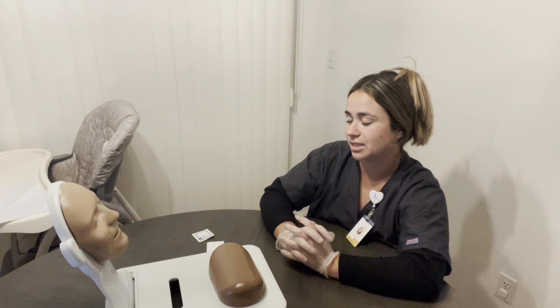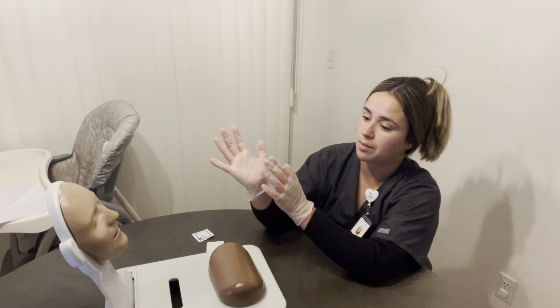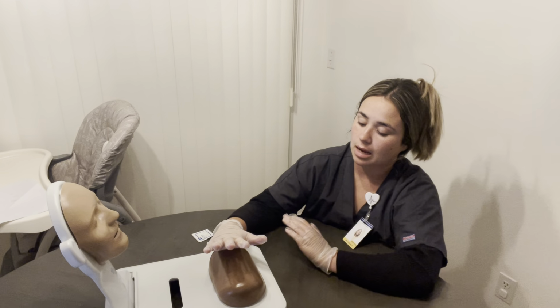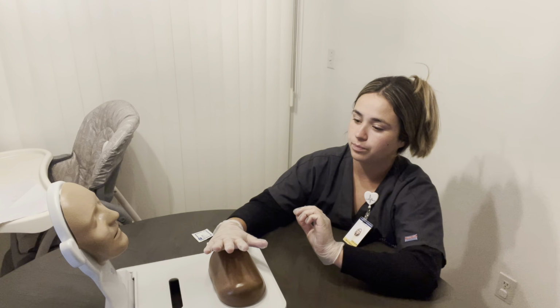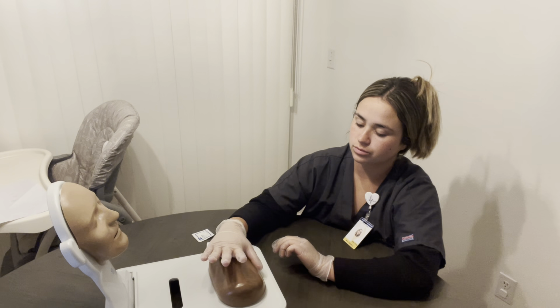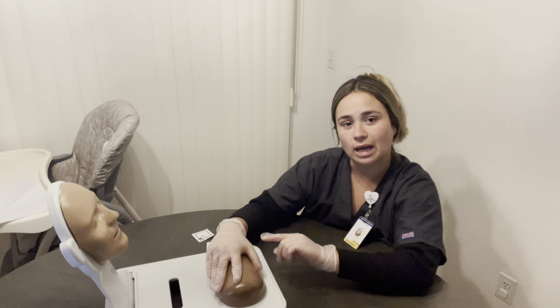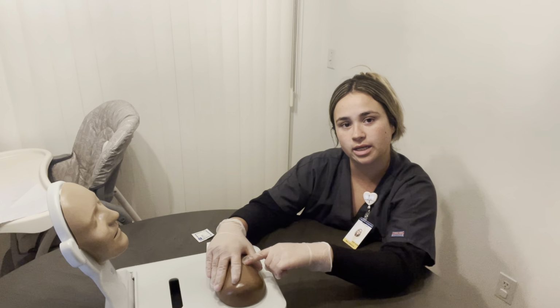Okay, once we do that, then I'm going to place my hands on the site to go ahead and find the exact location, okay? So what we do is I'm going to go ahead and place my palm on the greater trochanter, right there. And then I'm going to place my thumb pointing at the anterior superior iliac spine, and then this finger is going to be the posterior iliac crest, and then these ones are going to be pointing towards the buttocks. So as you can see, we have like a V shape, and the medication gets injected right in the middle right here, okay?